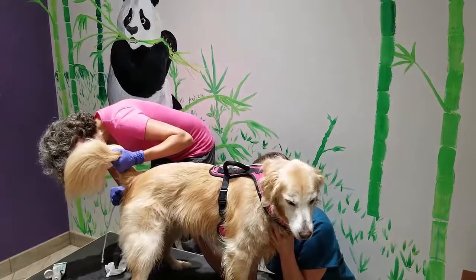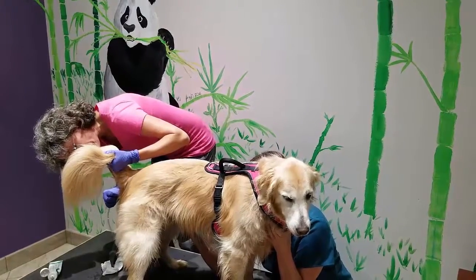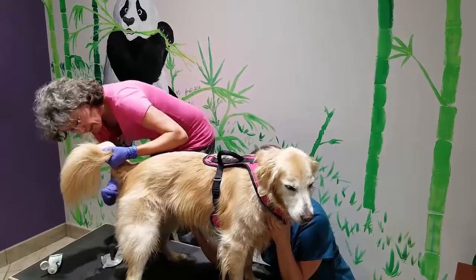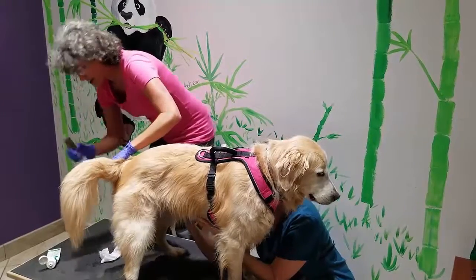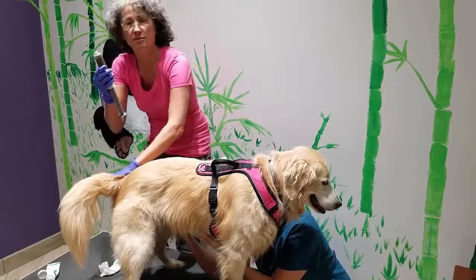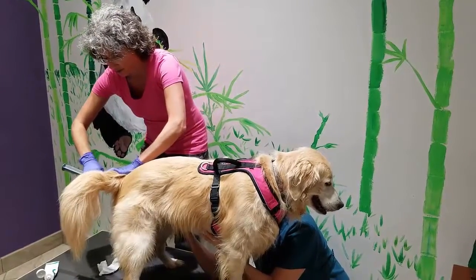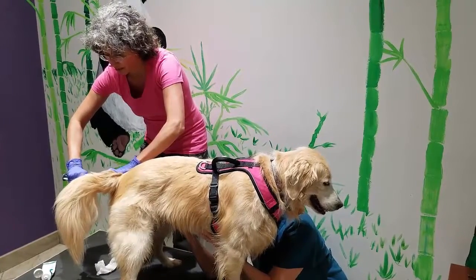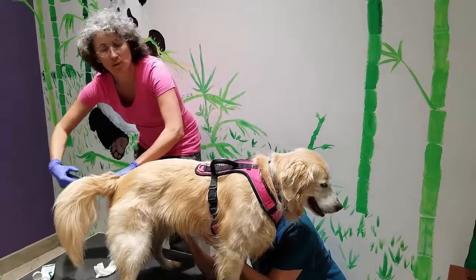She's very good. Now it's all free and clear — she's emptied out — and then I have my fecal transplant mix from my donor dog Onyx. It's just poop that's been blended up with saline and then put through a strainer and into the syringe so that it goes through the little tube.